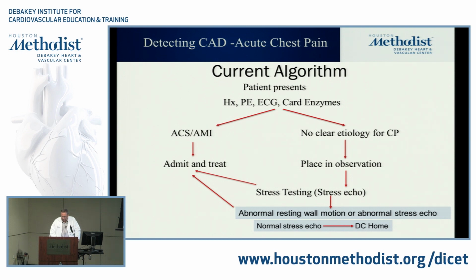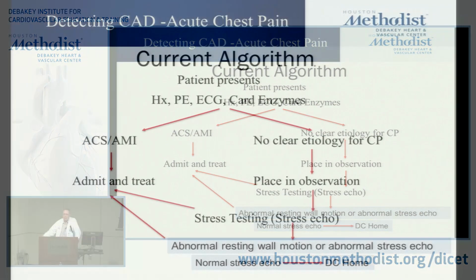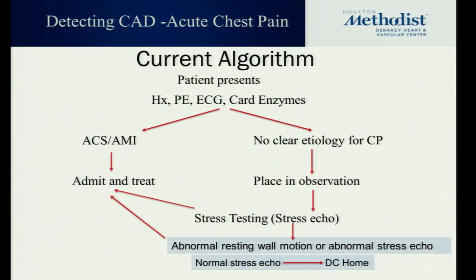Yeah. No, we don't have that here, and I agree with you. What happens here is a patient is sent for dobutamine, and people don't want to change to exercise without the permission of the doctor, and that further delays, so you end up doing the dobutamine, which really is a mediocre test. Dobutamine stress echo is a mediocre test. It doesn't have the same qualities overall of exercise. And if the patient has hypertension and LVH, it's even worse.